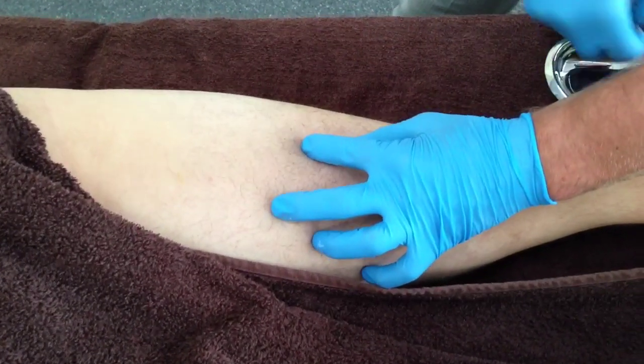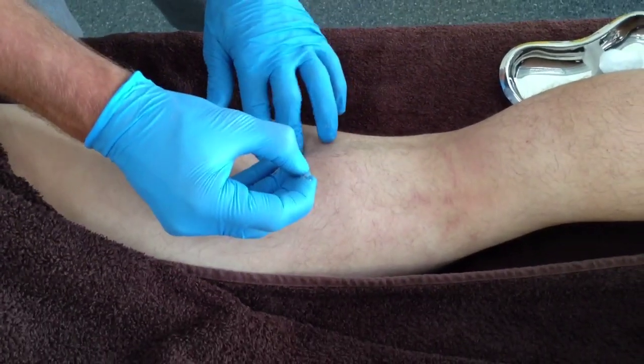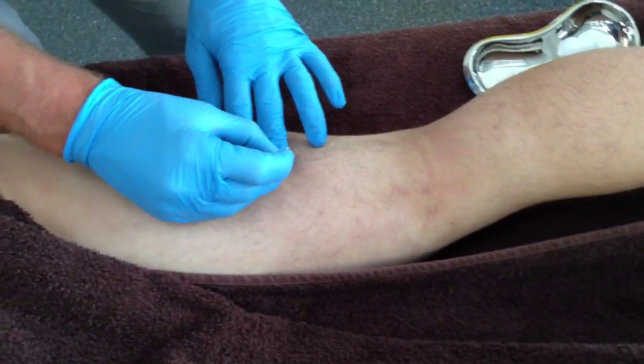Using this palpation technique, the trigger point taut bands can be identified and needled safely at an oblique posterior to anterior direction.